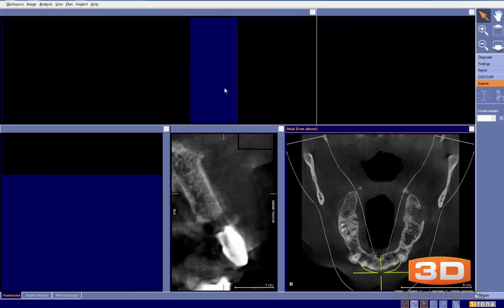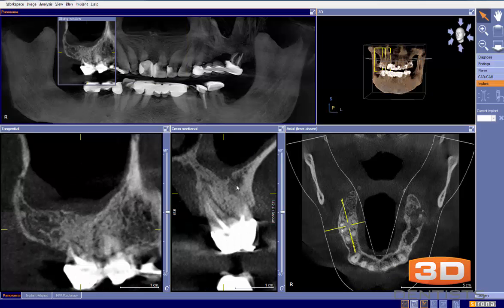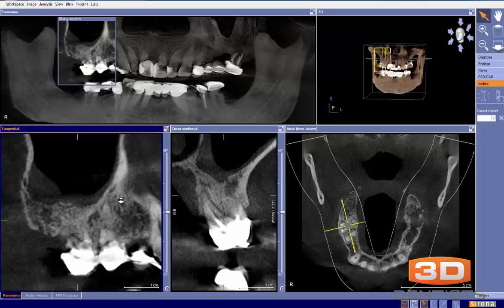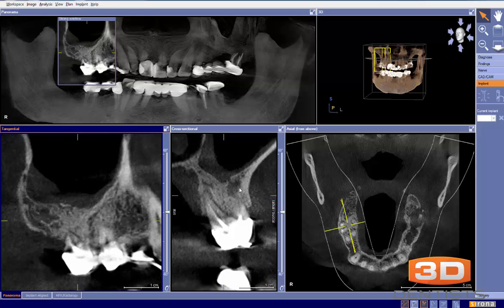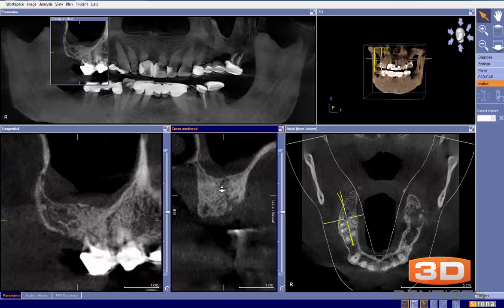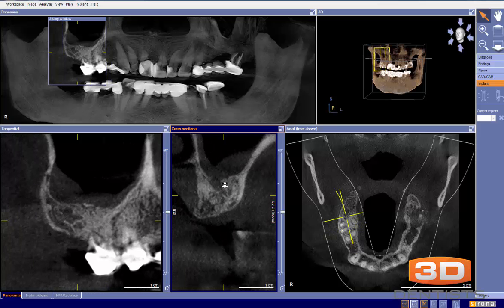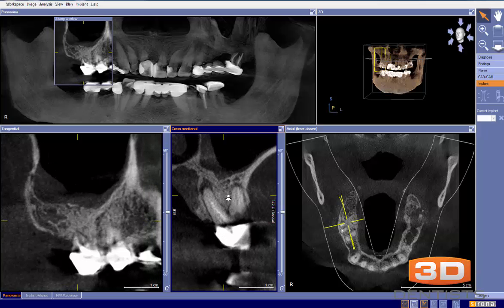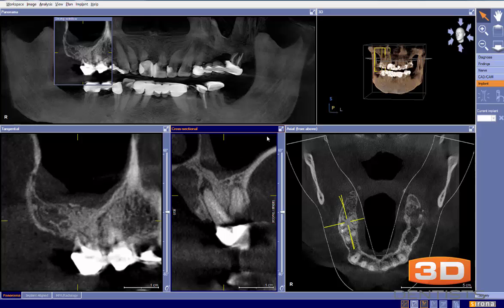What I'll do then is come in and look closely at tooth number three, center it, and literally walk through the tooth slice by slice. Now we're in the distal site where tooth number two used to be, walking through — and what I'm seeing right now is that this infection is limited to just this area. It's not communicating into the sinus, so far.